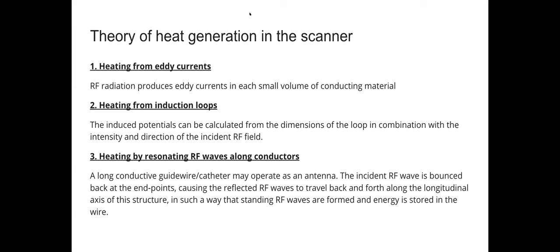All right, heating. Heating is relevant to MR safety, as Rebecca suggested, as well as MR-compatible therapeutics, such as thermal treatment or tumor ablation. And we were interested in ablation via HIFU, which deposits energy to a single point in the body. So to replicate this setup, we look into theories of heat generation in the scanner that could produce local heating. So generally, there are three mechanisms.